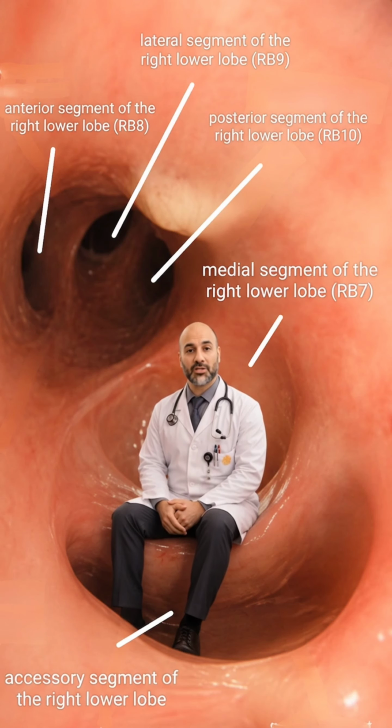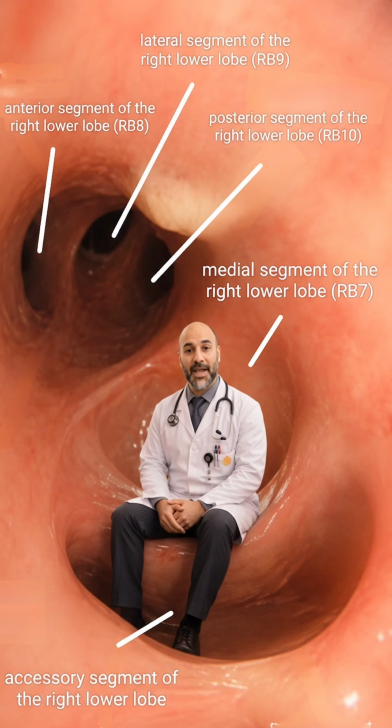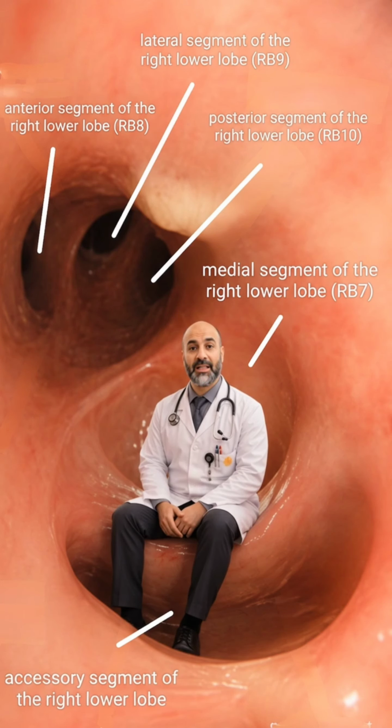Here we can see the bronchoscopic view of the right lower lobe. The bronchus divides into the superior segment and the basal segments. At the basal part, we can identify the medial, anterior, lateral, and posterior segments, corresponding to RB7 through RB10.